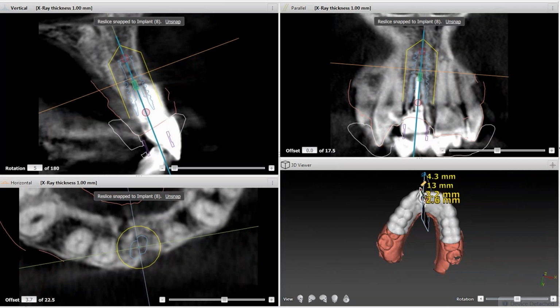Immediate extraction, another case. The patient came with a failing root canal treated tooth. The buccal bone and lingual bone appear to be intact. As you notice, we are placing an implant and submerging it because this is an immediate. We are expecting some bone remodeling. Overlay the models and the guide, everything. This is a cross-section buccolingual view. You can see the implant. This is where the guide sleeve would be. We have a plan for the crown. Chances are we may or may not be able to load.